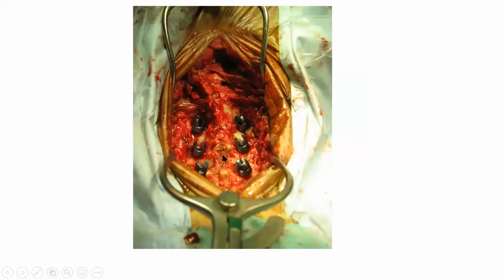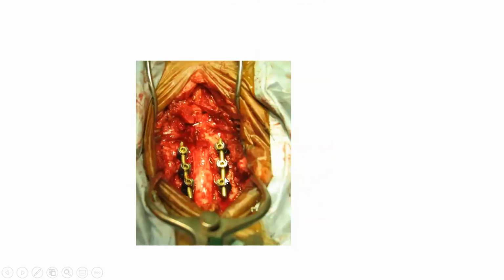So this is a midline; the spinous process has been nibbled away. The lateral mass screw goes laterally. I'm going laterally to avoid the vertebral artery in front. And all you do is connect to the rod, and there's your laminectomy. I've taken the lamina off here, so the spinal cord is exposed.